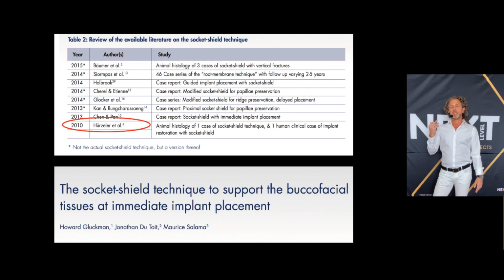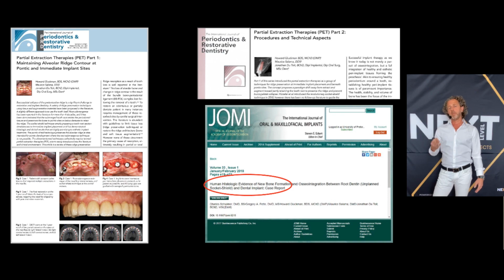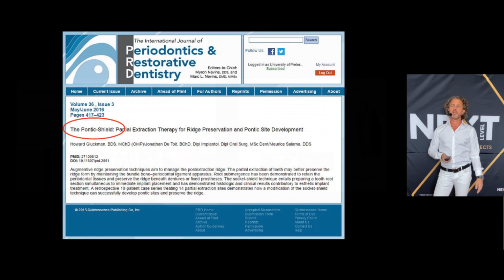So the literature, going back to 2010, described this phenomenon, first by Attila and his team, but the number of these articles is increasing day by day, which is very interesting and proves to us that this is a really, really good solution. Those histologic studies prove to us that there's real bone formation between the shield and the implant surface, and this is very, very impressive.